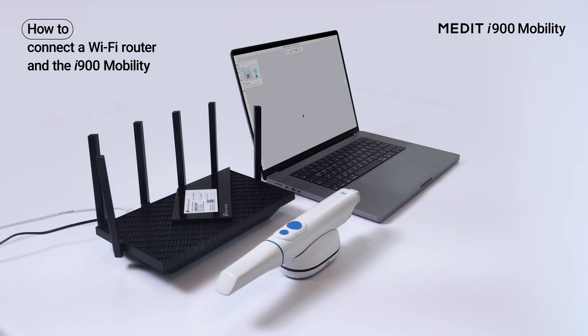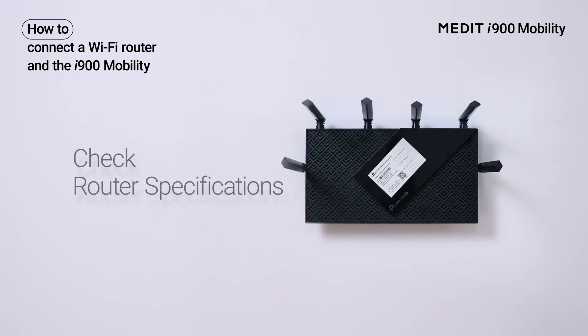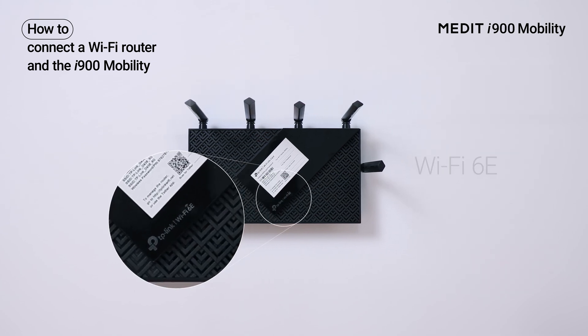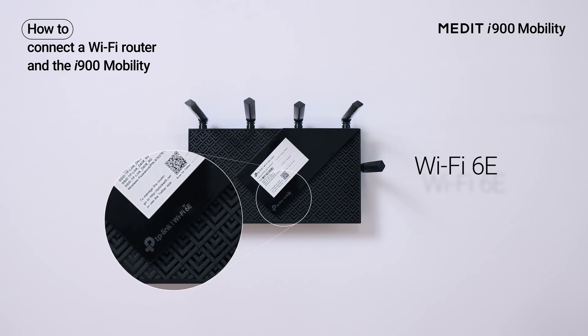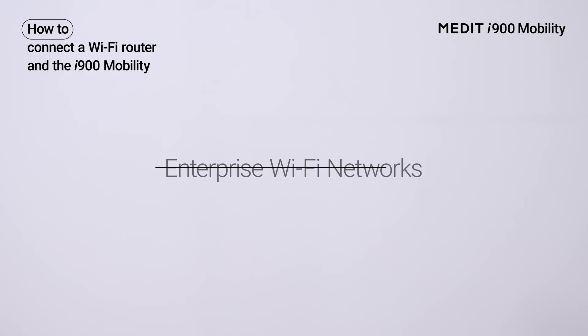Next, let's set a Wi-Fi router without the wireless hub. There are a few requirements when using a Wi-Fi router. Before connecting, check your router's specifications — we recommend using a Wi-Fi 6E router. For security, connect only to password-protected Wi-Fi networks, and note that enterprise networks may be restricted.